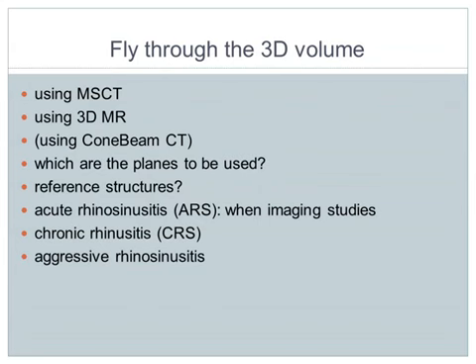The third point that we will cover is the introduction of cone beam CT in this field, with the advantages of a low dose for the patient, at the advantage of an increased spatial resolution, though the acquisition time is a little bit longer, and therefore patient cooperation is one of the problems to solve.